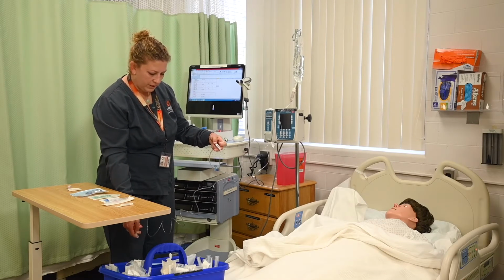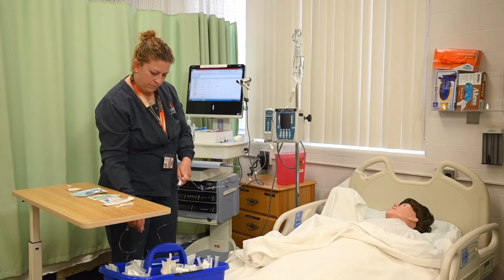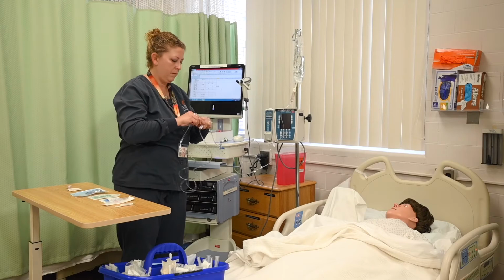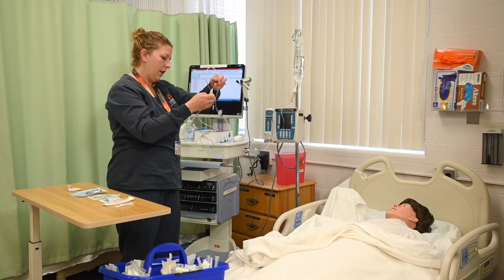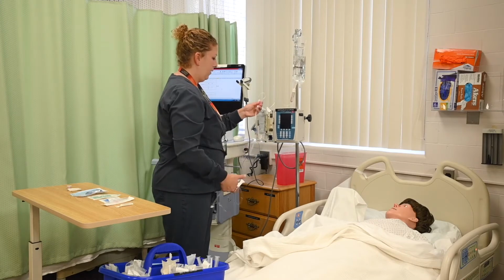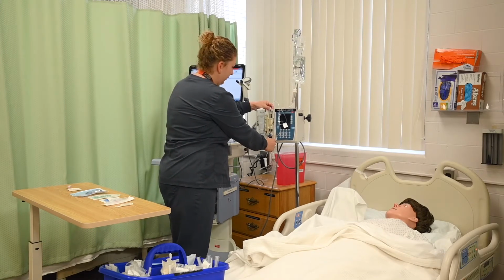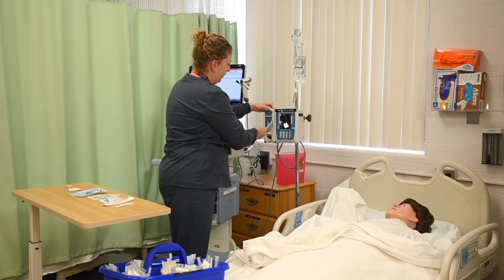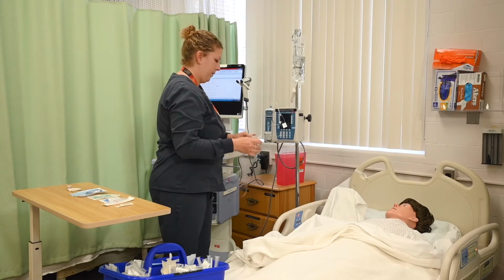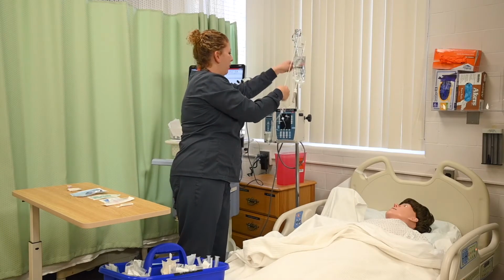Making sure that all air has been expelled from the tubing. And then again closing my roller clamp. I'm going to insert the tubing into the pump and hang the IV for use when I'm ready.